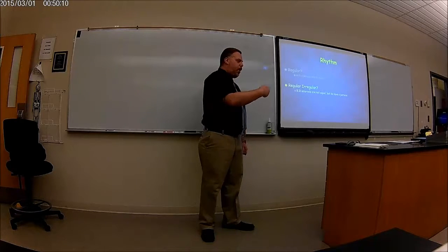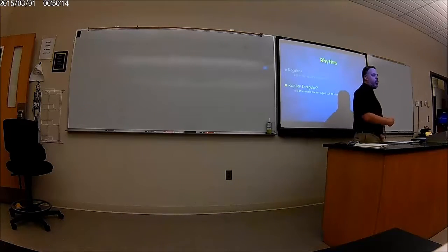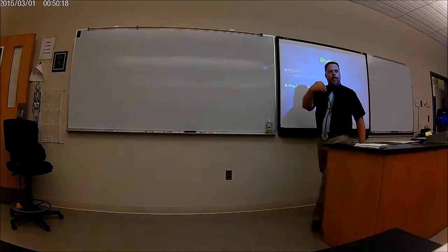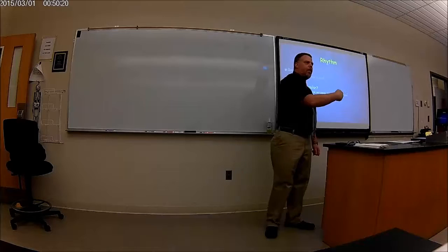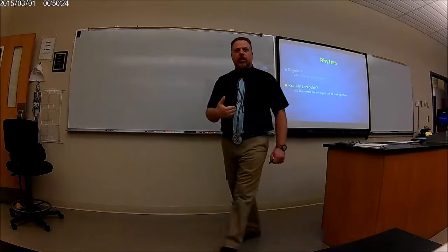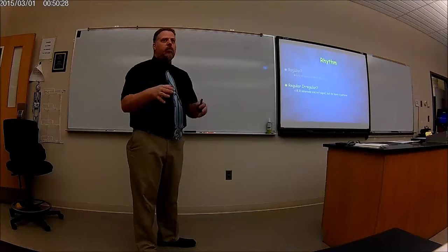So it's going bop, bop, bop, bop, bop. Normally it would go bop, bop, bop, bop, bop. But now you got bop, bop, bop, skip, bop, bop, bop, skip, bop, bop, bop, skip. So there's a pattern there. So we say that it's regular, there's a pattern, but it's still irregular.